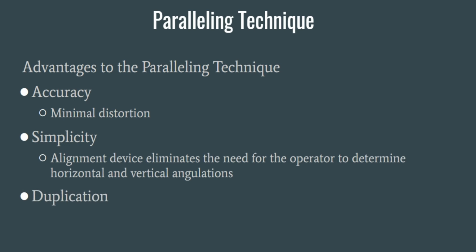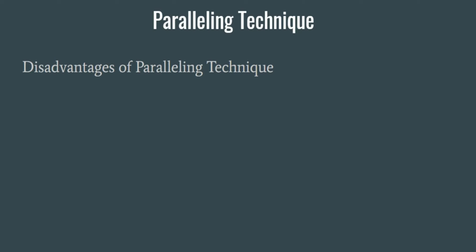And for duplication purposes, it's easy to get the same shot again with the paralleling technique if you are using your XCP correctly. It is much easier to take a similar shot when you are using that alignment device. Like everything that has an advantage, there are going to be disadvantages. Patient comfort can be a problem here, but we have ways to get around that.